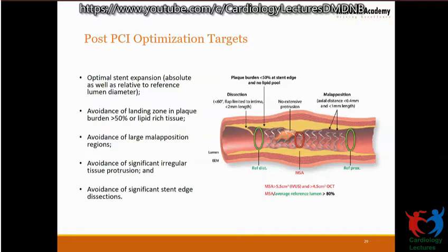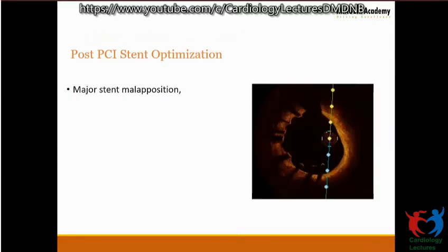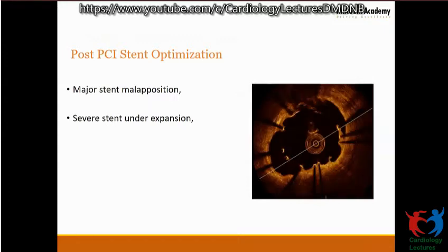Try to avoid tissue prolapse, which occurs both in stable as well as in ACS situations. So, a case example of that. And as far as possible, optimize your stents so that you have good end results. Here are some OCT pictures of stent malapposition. Between the 3 and 9 o'clock positions, the stent is malapposed. Here you have the image of an under-expanded stent. When the malapposition is circumferential, we call it under-expansion.